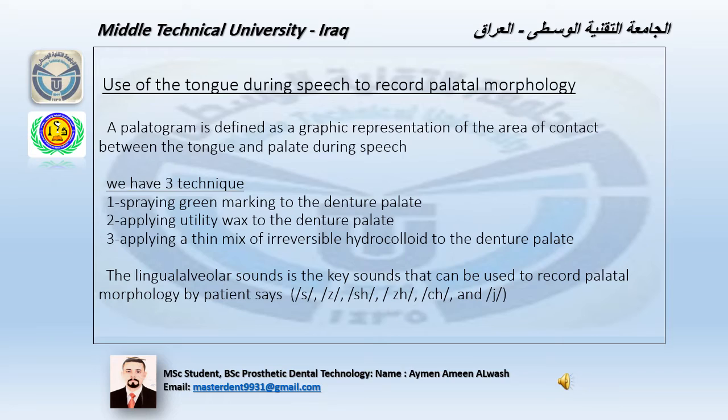Use of the tongue during speech to record the palate morphology. A palatogram is defined as a graphic representation of the area of contact between the tongue and palate during speech.